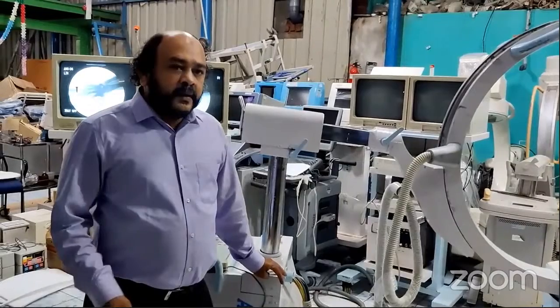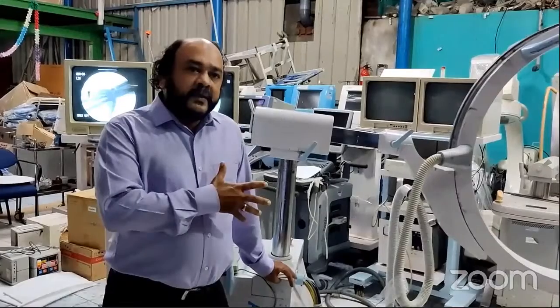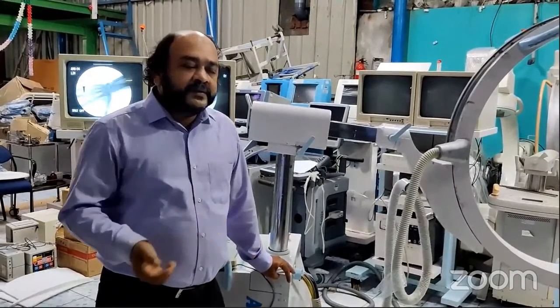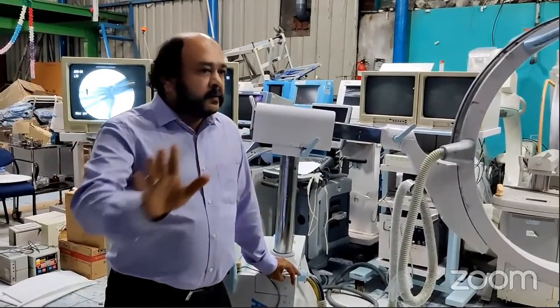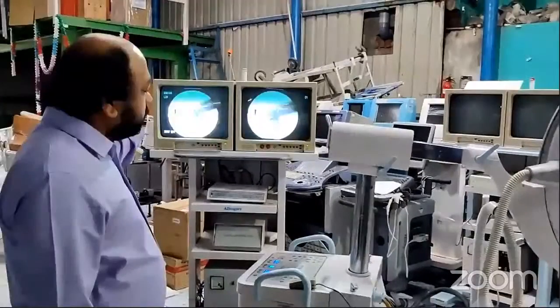And it also has a memory unit. It stores the image. Suppose during the surgery they take a shot. First they will take a picture and they will store it in the memory unit.